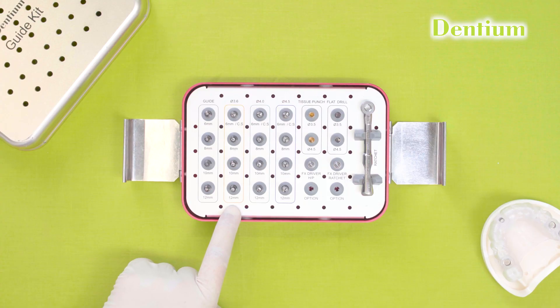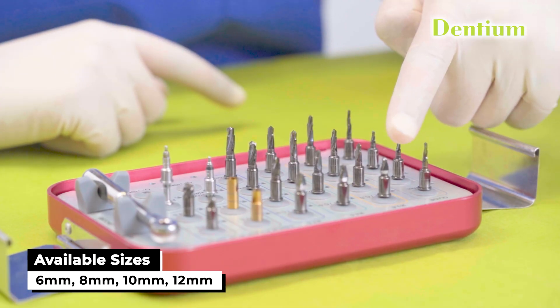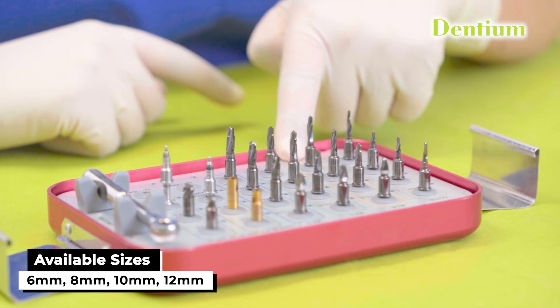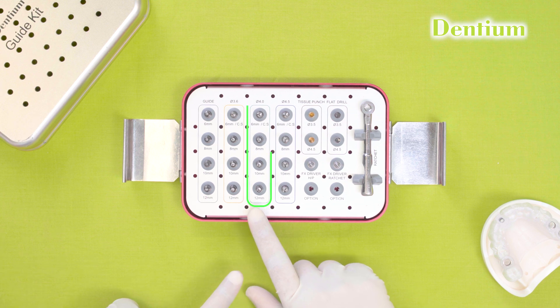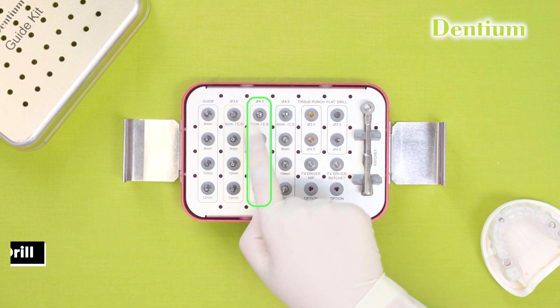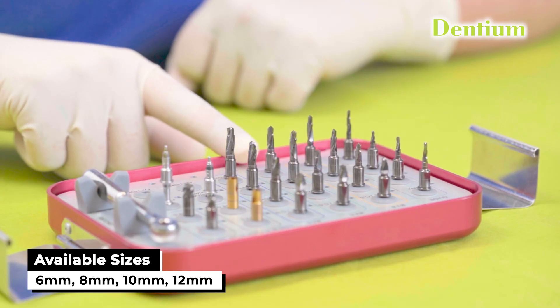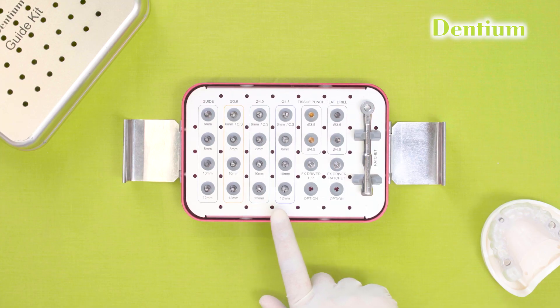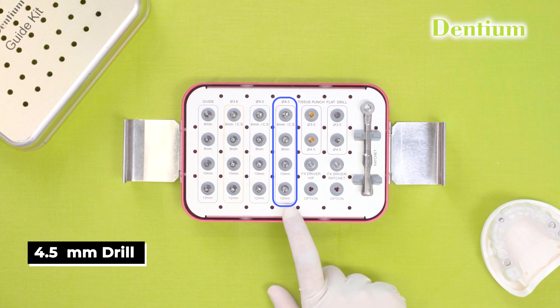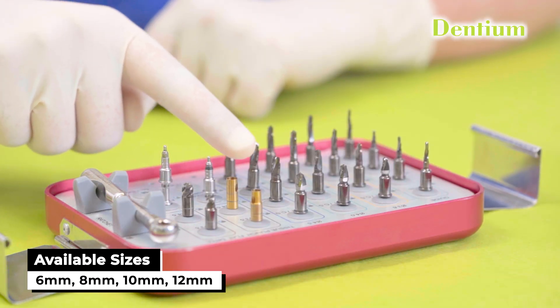The next drill is 3.6 mm, denoted with a yellow color band, available in 6, 8, 10 and 12 mm length. The next drill is green color, that is 4 mm, encircled with a green color band, again available in 6, 8, 10 and 12 mm. The next diameter is 4.5 mm, encircled with a blue color band, available in 6, 8, 10 and 12 mm.